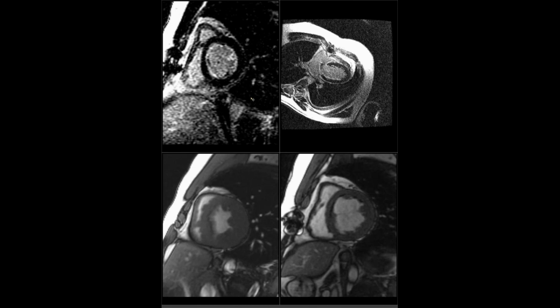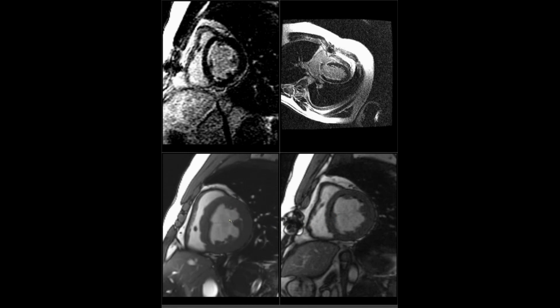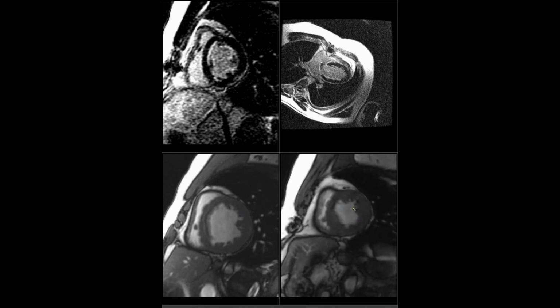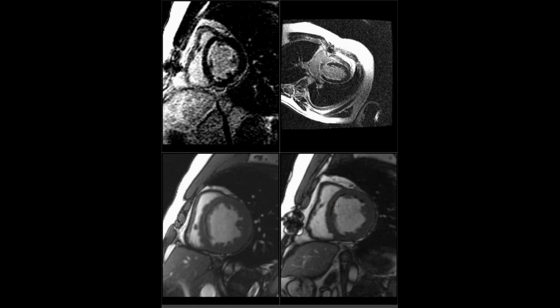Excellent. So this is a 20-something-year-old with a previous history of aortic coarctation and now a conduction abnormality that they're calling Wolff-Parkinson-White. Also had a mechanical aortic valve. This is his MRI from 4 years ago on the bottom left, and this is the most recent one. Back then the ventricular wall was pretty thick, and there were some excessive trabeculations. Then it got a little thinner over time, not a whole lot, still relatively thick. And there's now this area of chemical shift artifact, predominantly anteriorly.